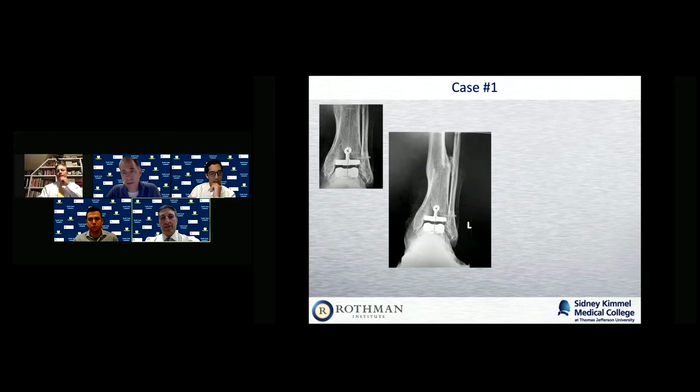Sure, I mean, does it look loose? It's not loose. Brian, yeah, it might be an alignment issue. Exactly. Basically it's the axis that the implant was put in along the distal segment, when it should have been, if you were not going to do an osteotomy, done in conjunction with the proximal segment, which probably had no deformity, I'm assuming. Correct.